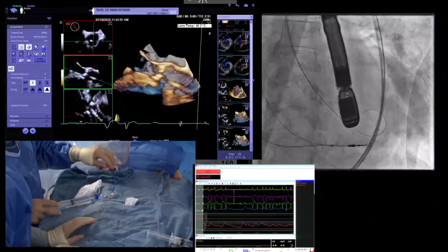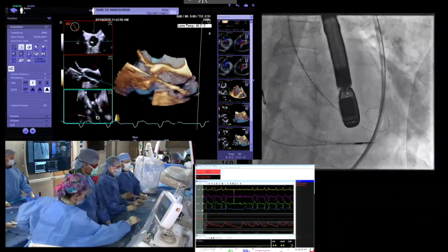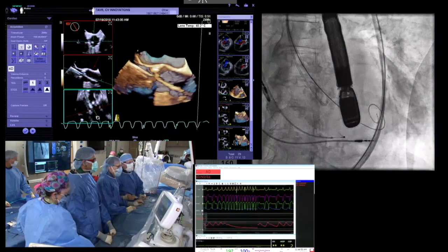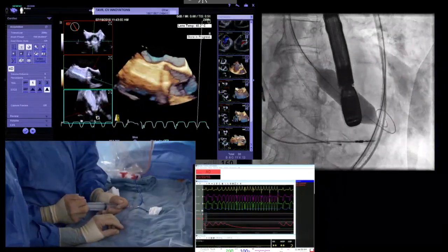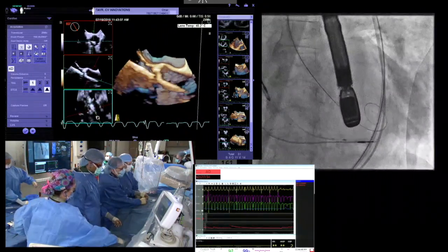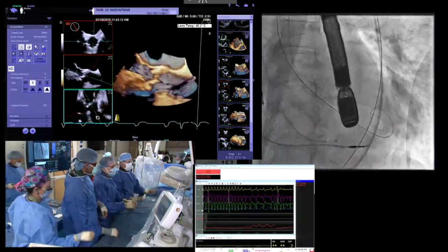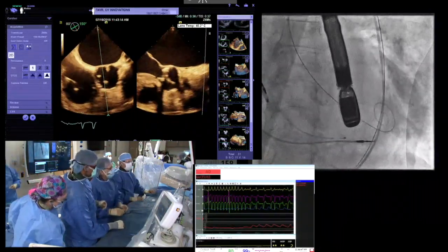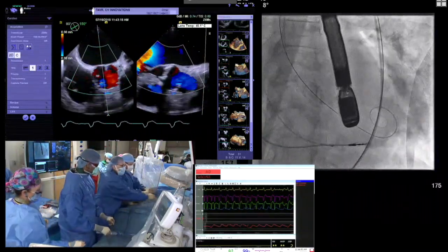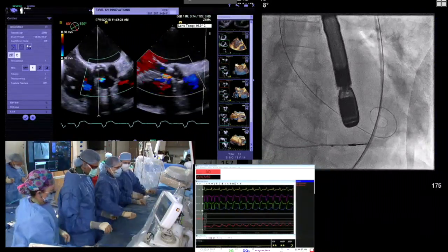Dr. Schwartzstein, rapid pace, bring the lungs down. So we do a BAV on most of ours, Bob, and this is an 18 True balloon. And down. Yeah, we didn't see a lot of leaflet calcium. You can bring the lungs up and stop pacing quickly, please. We didn't see a lot of annular calcium. There was leaflet calcium, so you kind of saw the balloon move to and fro in and out of the ventricle and aorta. Bill, what percentage of the cases are you doing BAV on?